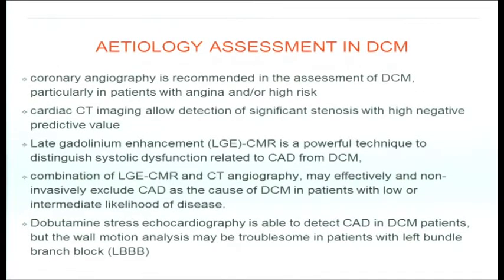We may have to go for a coronary angiogram, which is recommended in the assessment of dilated cardiomyopathy, particularly in patients who have angina or are considered high risk for ischemic heart disease. Cardiac CT can allow the detection of significant stenosis, as we discussed earlier in this conference, with a very high negative predictive value, especially in patients with low or intermediate risk of ischemic heart disease.